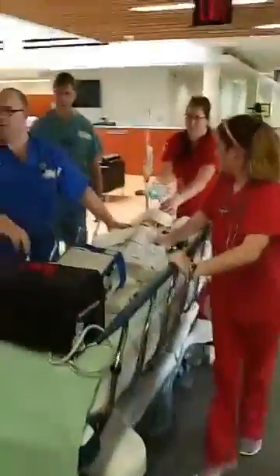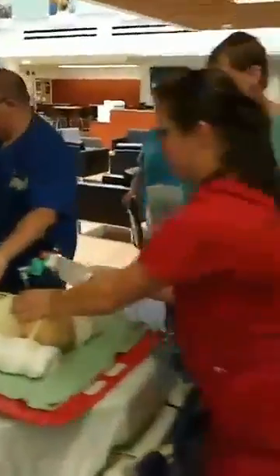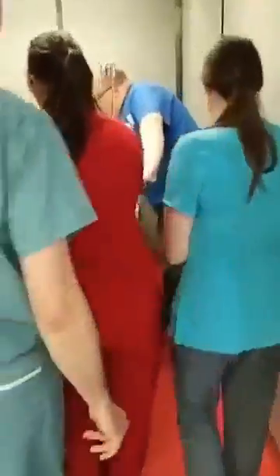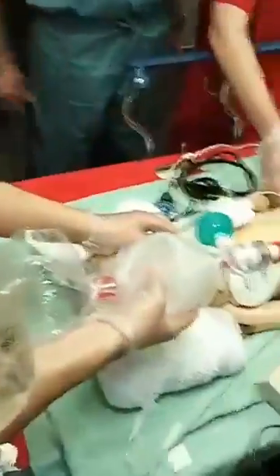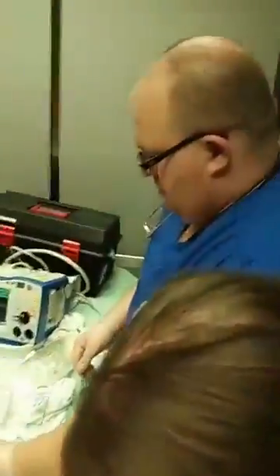All right, what are we going to do when we get in the elevator? Okay, let's have the bed go right down the middle. Yep. We want everybody on either side in case something goes wrong, we can react. Yeah. Okay, so what are you going to do next? Reassess. Pulse, blood pressure. How's our airway? We're getting chest rise. Secure. We're breathing. You can move that chest.